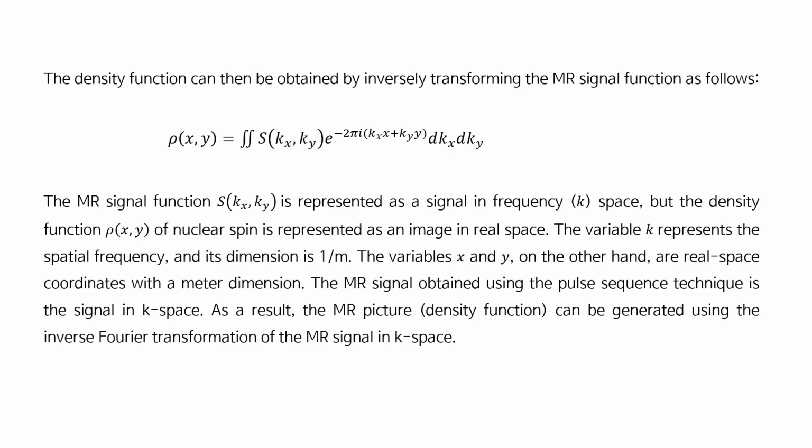The density function can then be obtained by inversely transforming the MRI signal functions as follows.